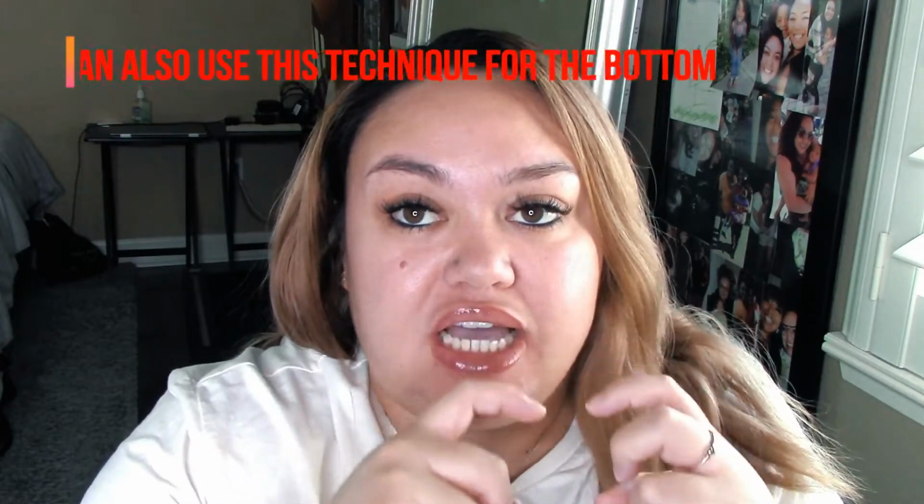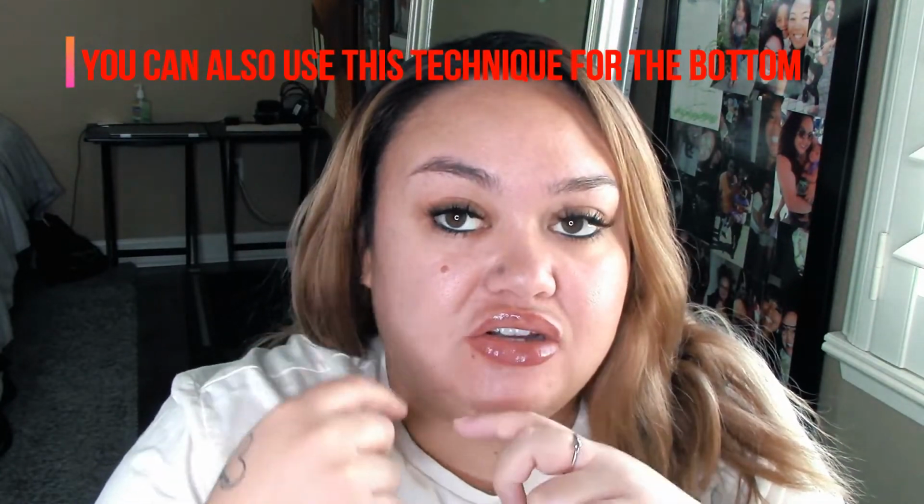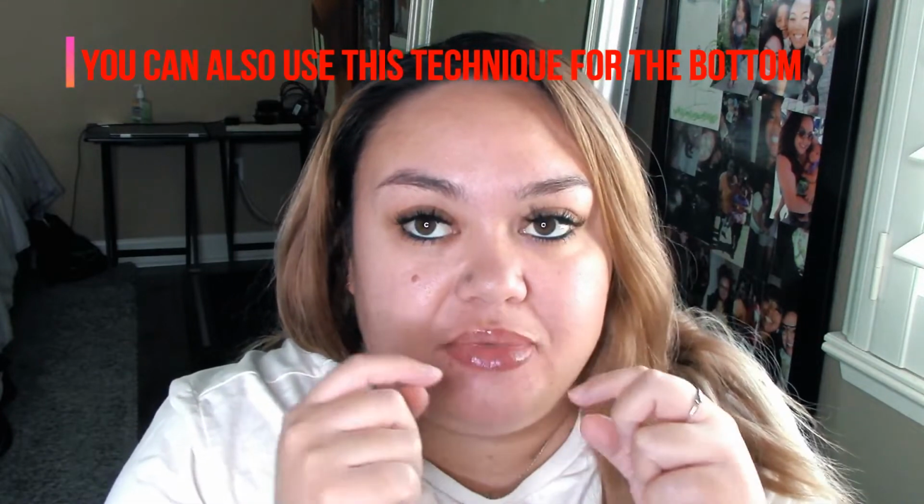Okay, so my hands are clean, so let me go ahead and take these out and show you how much of a pro I am. So I usually start on the bottom one and I just pull up. And then for the top, I start in the back, I pull down with both my fingers, one on each side, and then go to the other side, pull down, and then start in the middle.